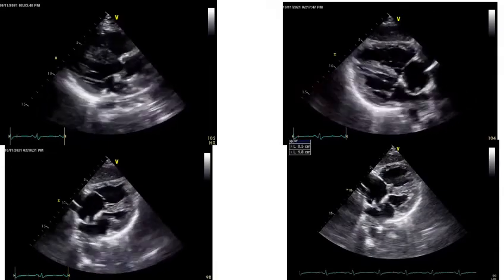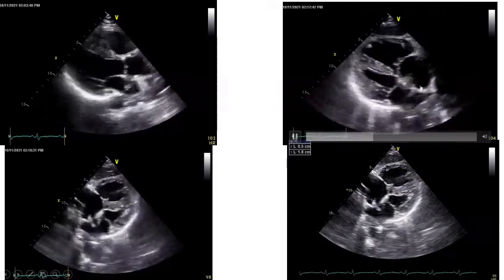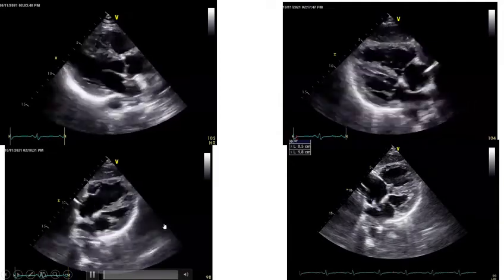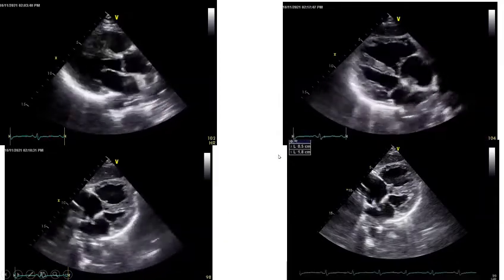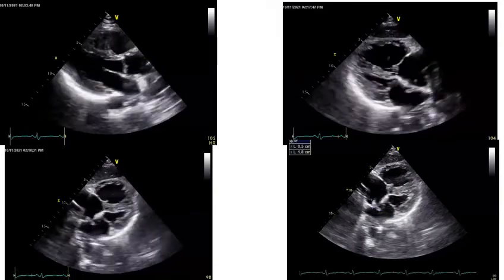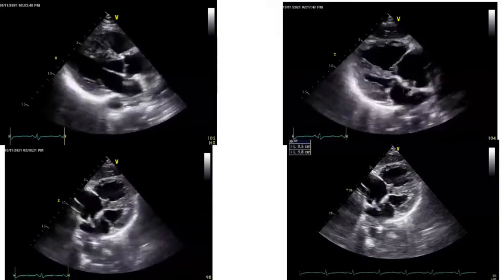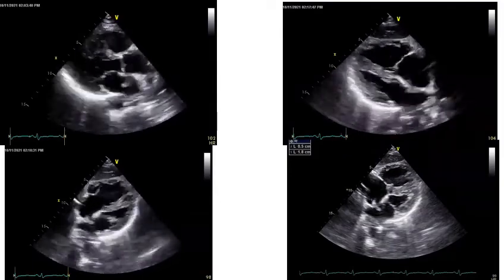Sir, inter-atrial septal aneurysm. What is this? Sir, inter-atrial septal aneurysm. Any other thought process? Thrombus, sir, paradoxical embolism going on. Yeah, very good. Actually, it is a thrombus migrating from the right side through the? Yes. Sir, ASD or PFO. More than ASD, it is patent foramen ovale.